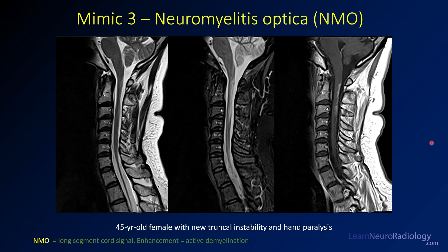Our third mimic is neuromyelitis optica — a long-segment transverse myelitis often associated with optic neuritis and aquaporin antibodies. Here on T2 and T2 fat-sat, we have a long-segment abnormality spanning about two to three vertebral bodies from the cervical medullary junction down to about C4. Similar to the sarcoid case, the enhancement is somewhat superficial and along the surface of the cord, with mass effect and expansion not being prominent features.